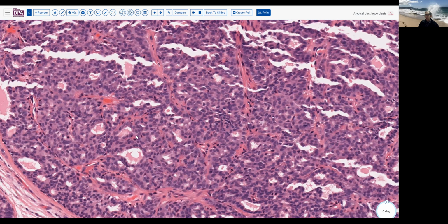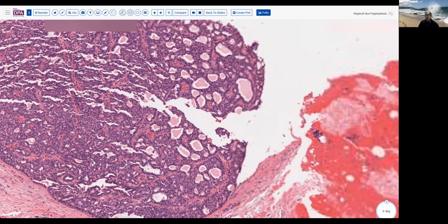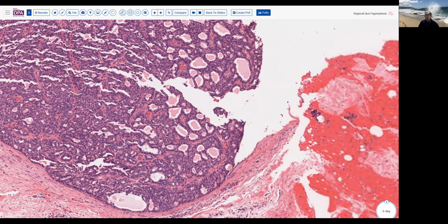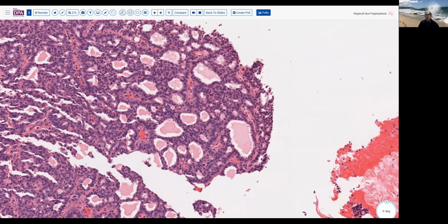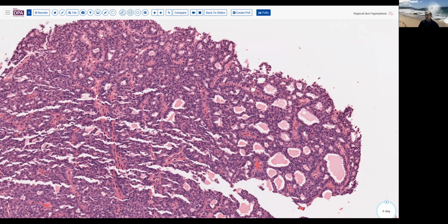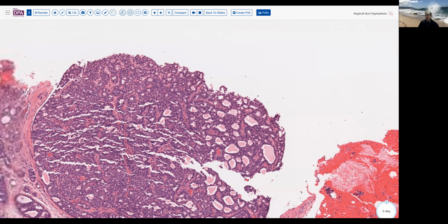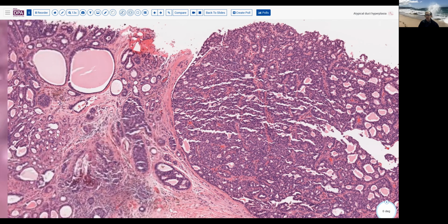This is a more confluent, probably papillary type structure. It certainly looks to be fairly confined, but there is some intraluminal architecture with blood vessels and so forth. Again, with these mostly rounded but slightly irregular features of the cells that are oriented towards the lumen. So again, I'm not quite sure if this is ductal carcinoma in situ or hyperplasia. It's sort of atypical.